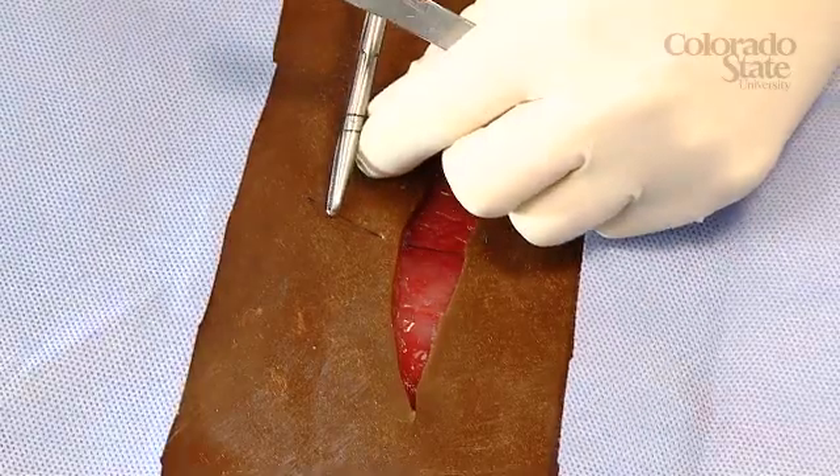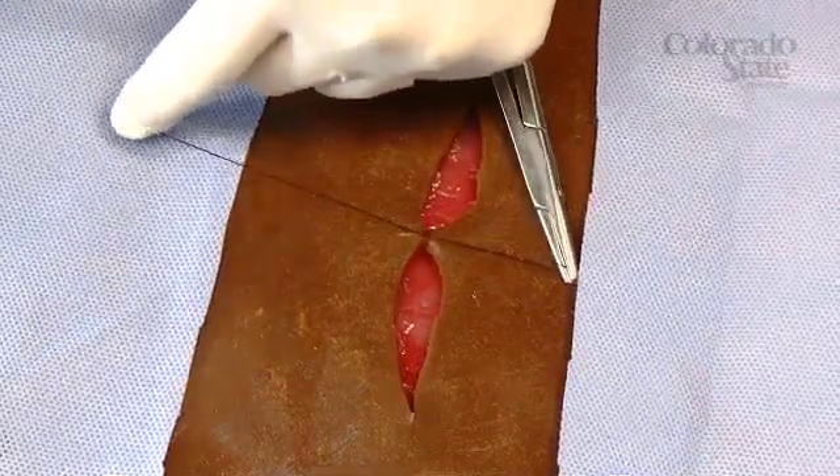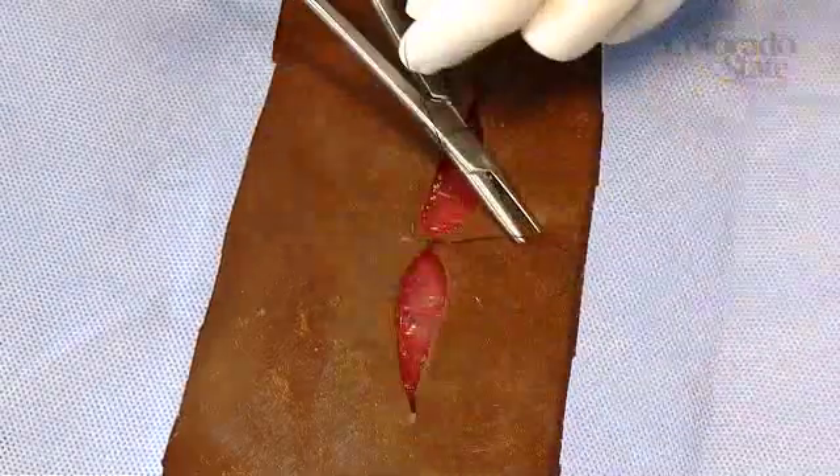The stress levels involved when real tissues are being sutured can be quite intense. So this new technology allows us to train our students using more realistic techniques. The tissue handles like it should, responds like it should, and what we really hope is it reduces the stress level between the didactic learning that they do in the classroom and their first live animal experience.